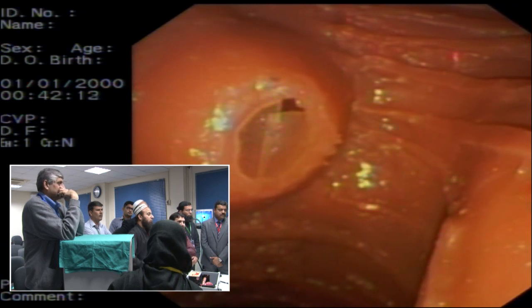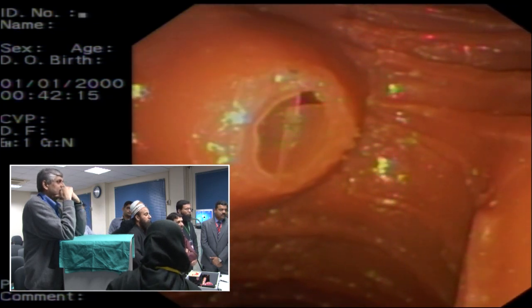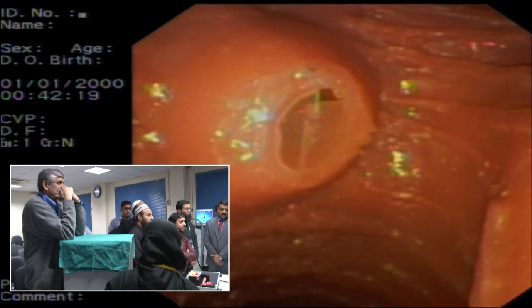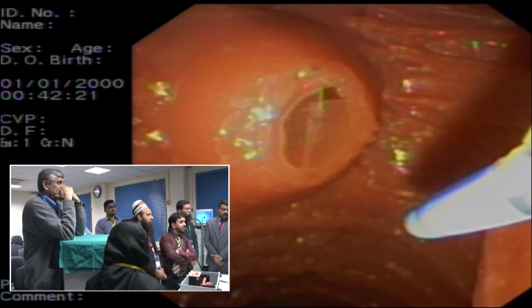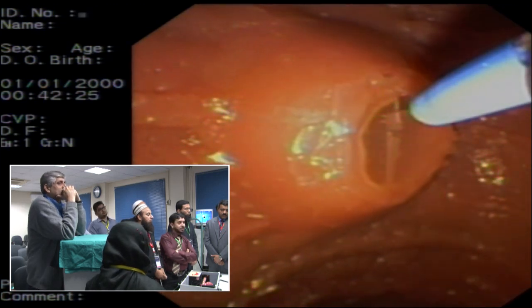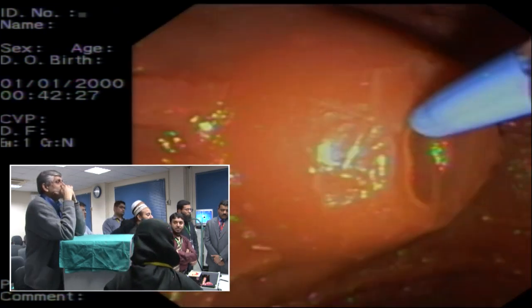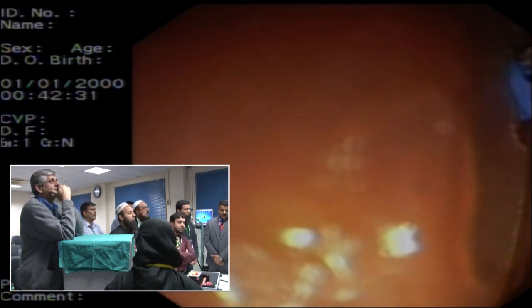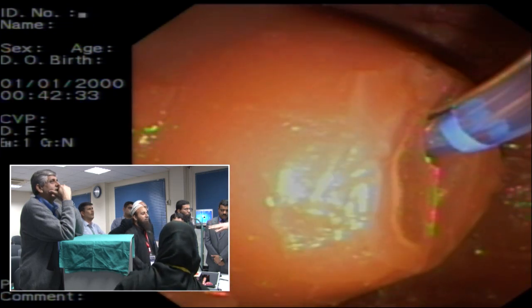दूसरा, हमेशा, I always give the example of cricket. जब आप क्रिकेट खेलते हैं ना, तो you watch the ball, not the bat. जब भी आप स्ट्रोक मारते हैं तो आप बॉल को देख रहे होते हैं. तो इसमें भी हमेशा your eyes should be glued on the screen. क्योंकि अगर आप एक्सेसरीज चेंज कर रहे हैं ना, तो आप उसको ना देखें. The moment he looked at it, जब वो डालने लगे, तो the papilla moved.